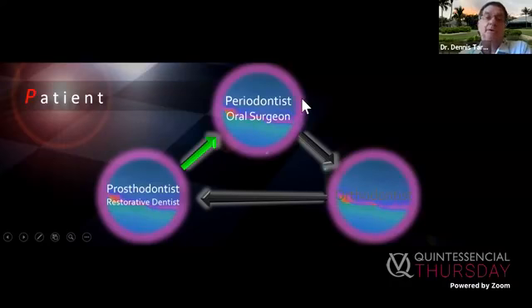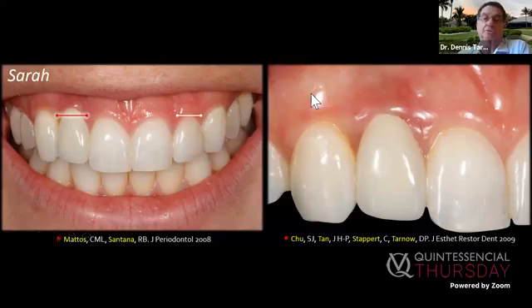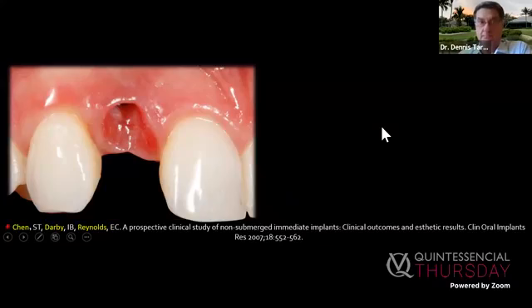And she's very happy. Now, sometimes you need to obviously do some surgery. In fact, most of the time you need to do surgery. I just wanted to show you what a restorative dentist can do. Let's take a look at this case. Here's a midfacial problem, but she has no thick tissue here. Different than Mary, she has very limited thick tissue here. So we're gonna have to build this up besides down. We need out and down.